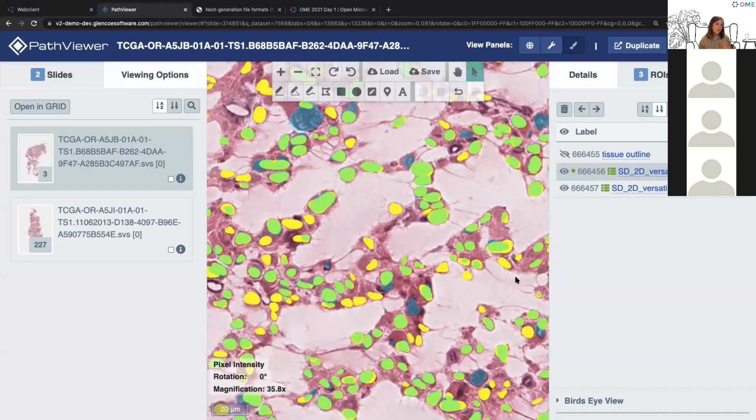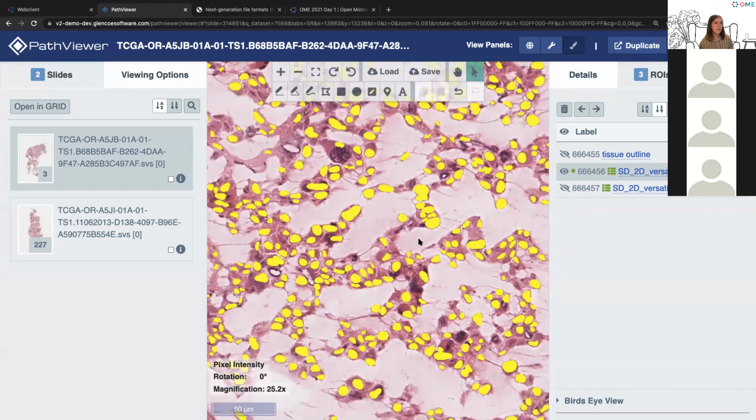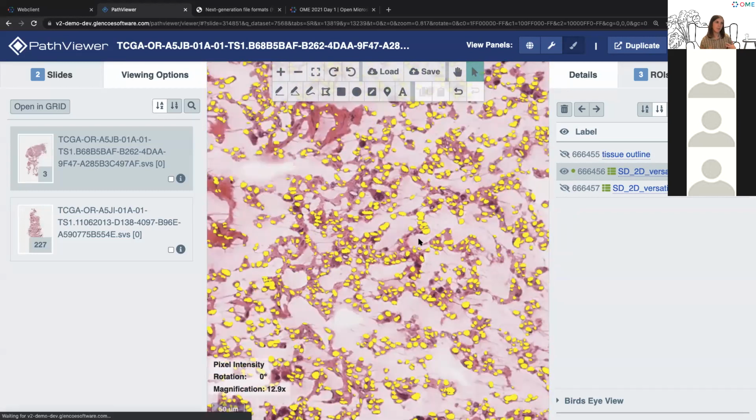So that brings me into the idea of measuring something about these objects and building, for example, a classification. One way that we're thinking about this is having this label image represent the final output of your segmentation. I'm going to consider all of these nuclei as true and real objects, but I might want to update their visualization based on some measurement that I've taken of them.